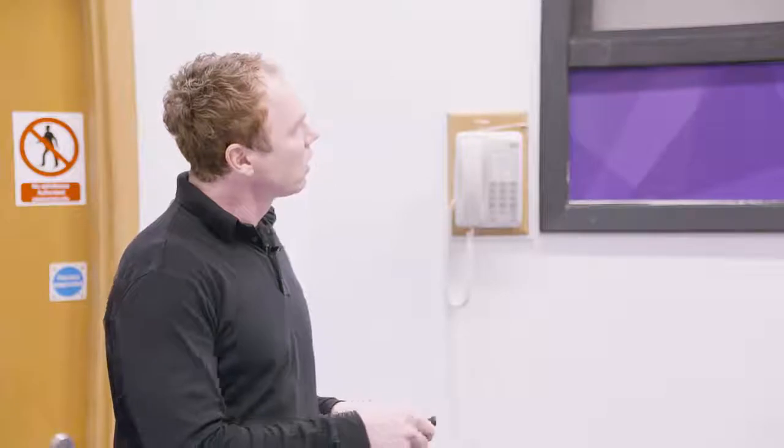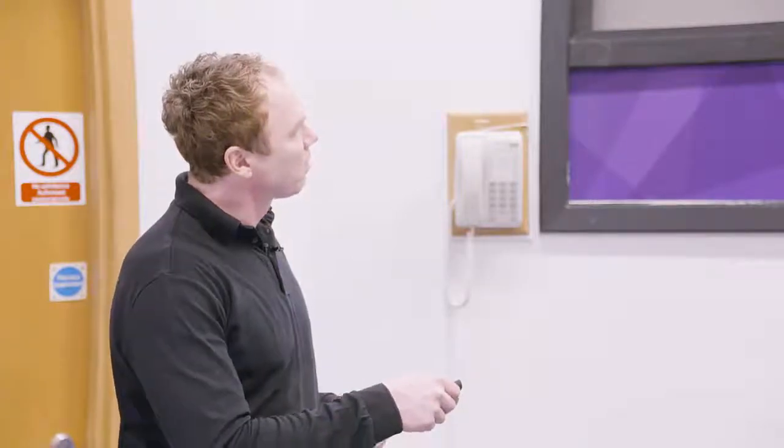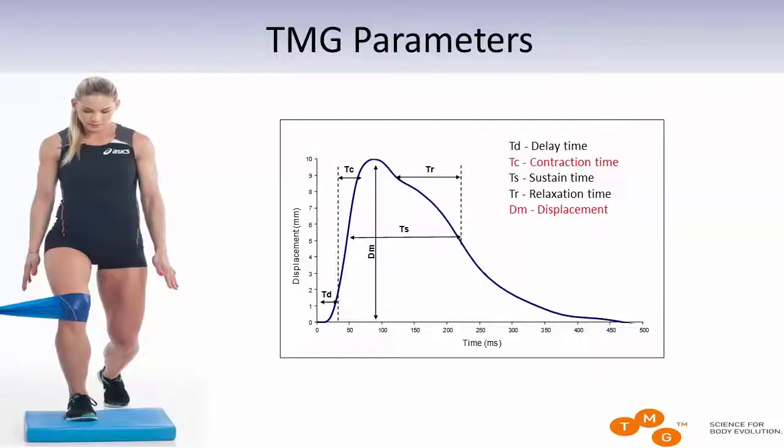And what you get as the result is a time displacement curve, which you can see here at the end. This time displacement curve is divided into 5 different parameters. So this is muscle twitch. If you look in literature, in most cases what you will get, you will have time to peak and then you will have time to relax.